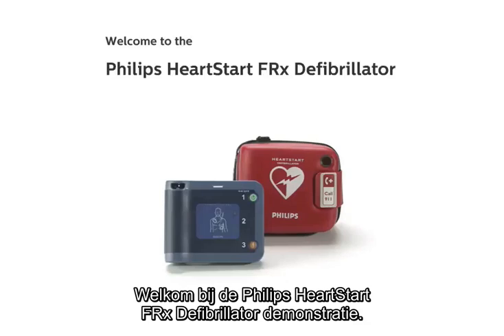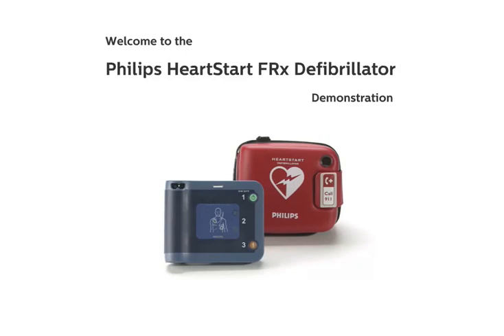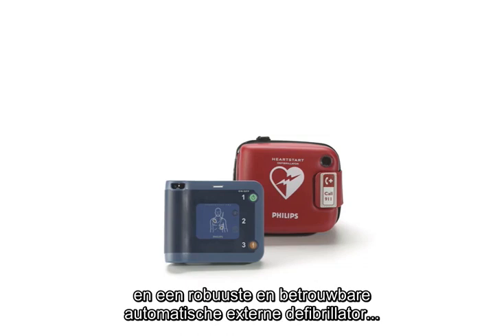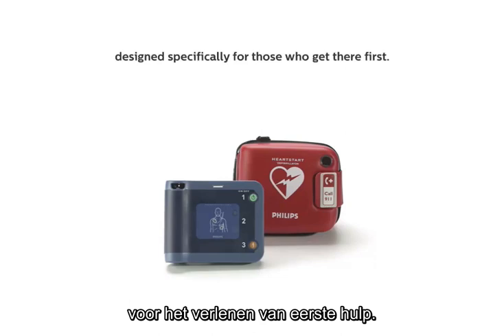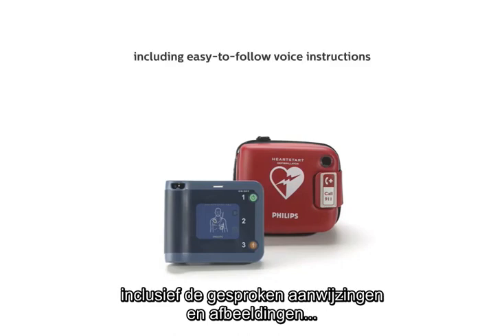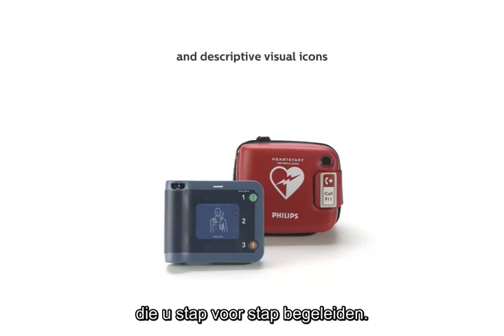Welcome to the Philips HeartStart FRX defibrillator demonstration. The Philips HeartStart FRX is designed to be an easy-to-use, rugged, and reliable automated external defibrillator, designed specifically for those who get there first. This demonstration illustrates the functionality of the HeartStart FRX, including easy-to-follow voice instructions and descriptive visual icons that take you through each step of the process.